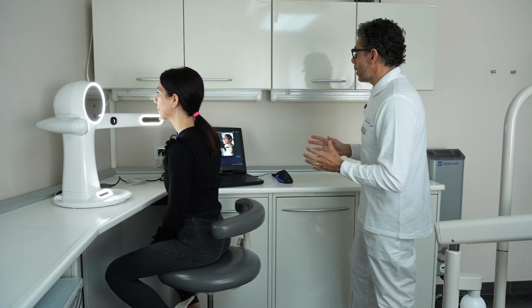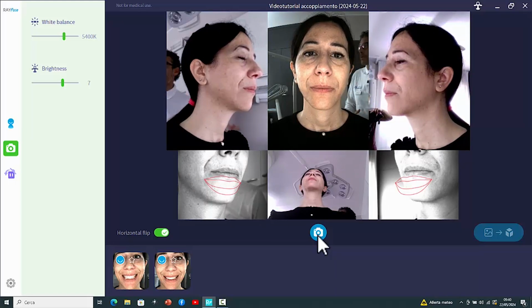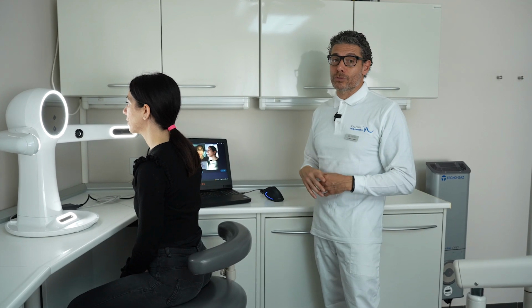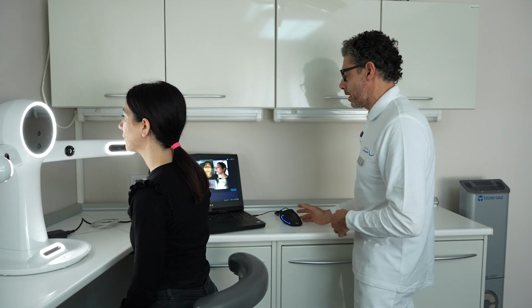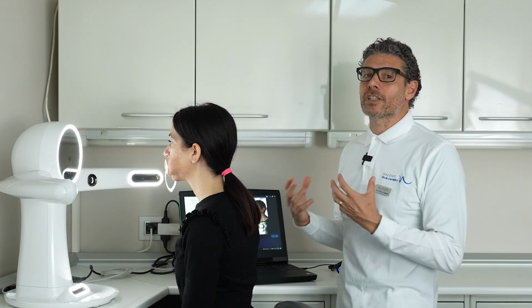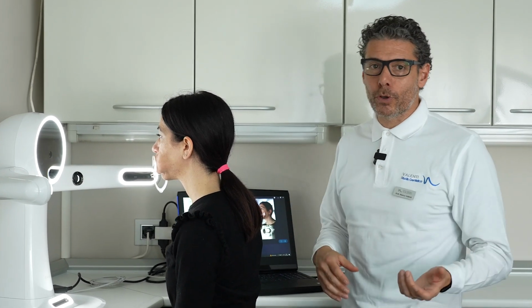In addition to its inherent quality, the RayFace 200 has the ability to detect the facial scan with a simple, immediate snap in less than a second. This feature provides us with a higher quality guarantee for the facial scans we capture, and we can capture as many facial scans as needed, with different types of smiles ranging from more exposed to less exposed.